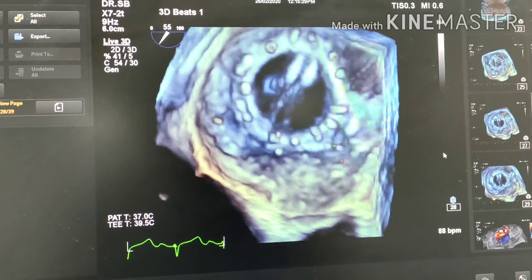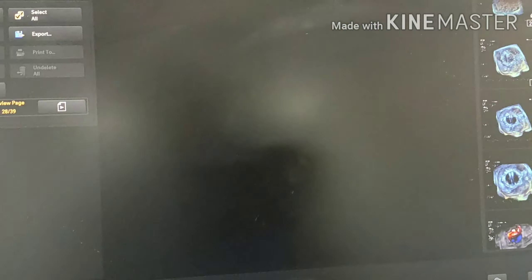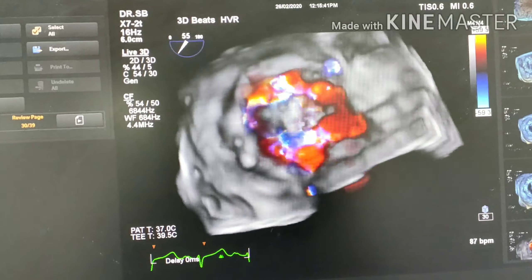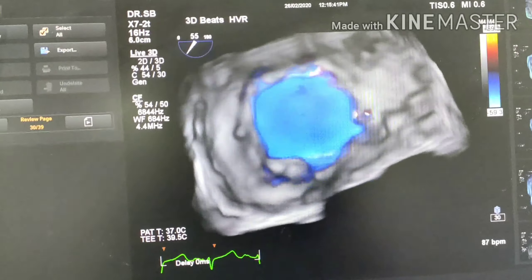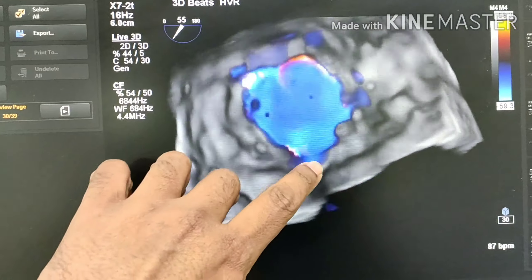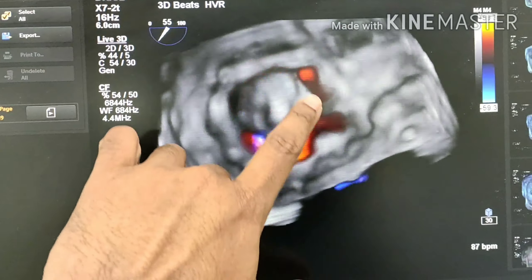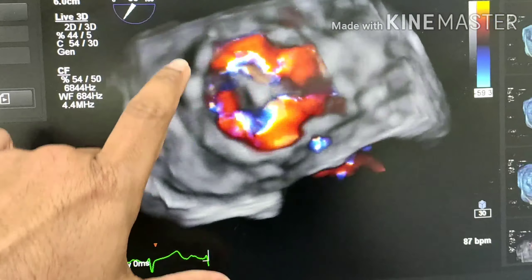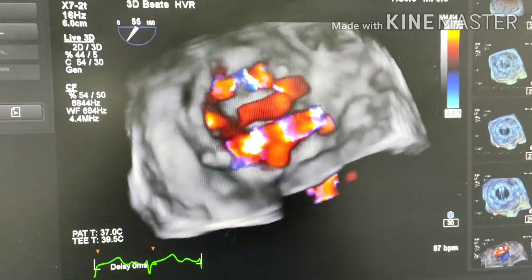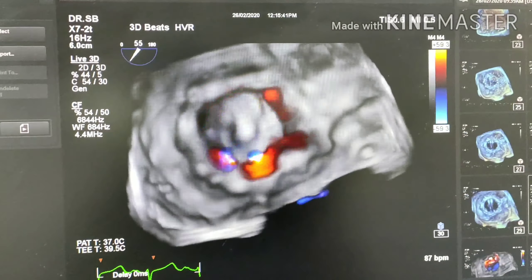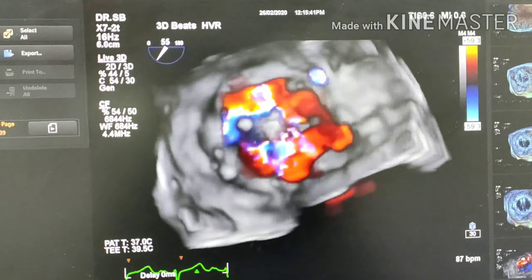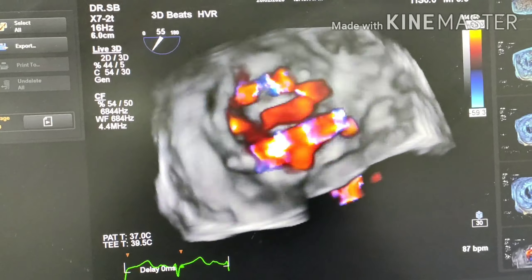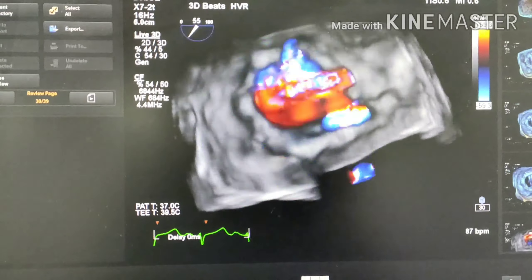Let's put color onto that just to see if there is any leak around the valve. There is no paravalvular leak. You can see the sewing ring, and all the flow is inside. There is no leak outside the valve ring. You can say for certain that this patient does not have any paravalvular leak.